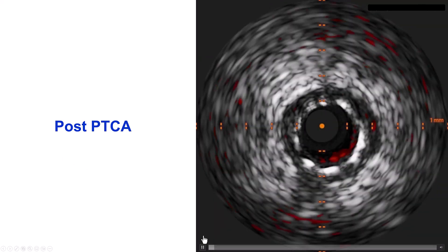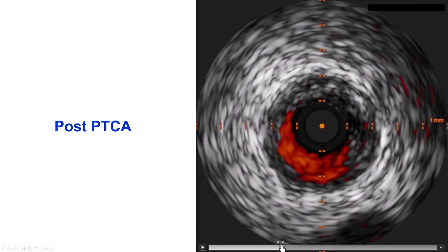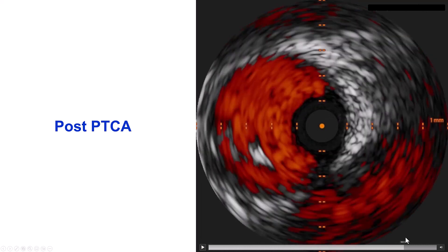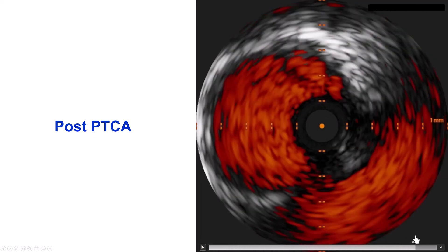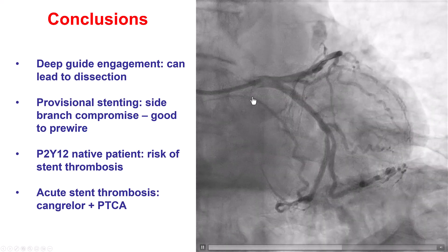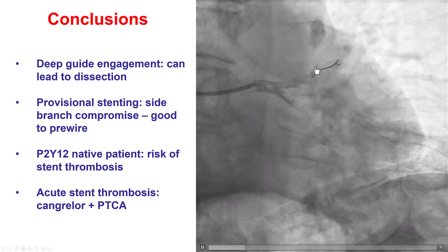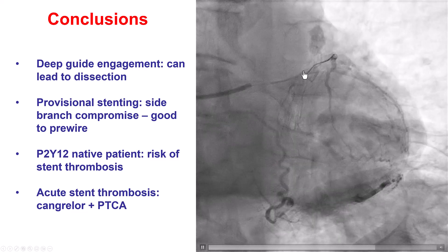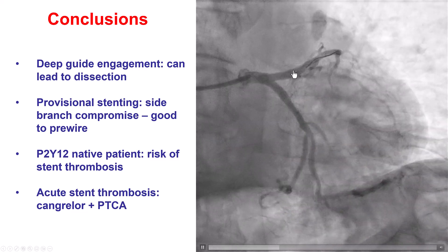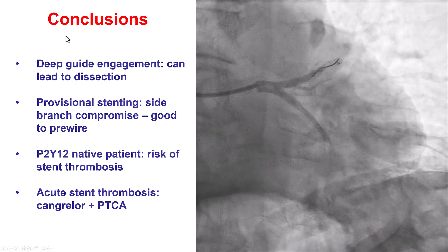This provided a nice result in the LAD. IVUS performed afterwards showed a nice result in the LAD as well as the left main, with the stent well expanded all the way back into the main. In the end, we did have a good result, although the patient did receive more stents than initially planned.